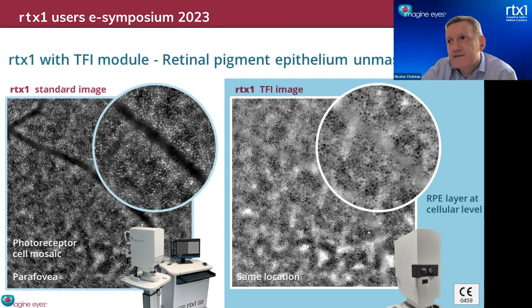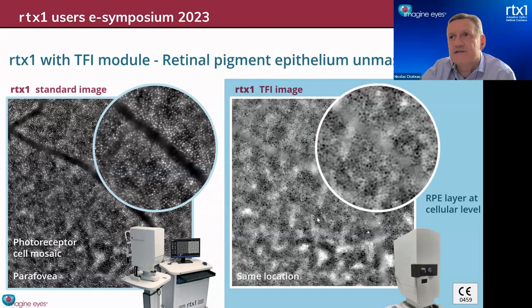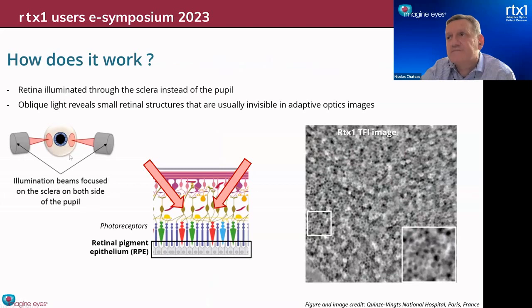So when we fit this module, the machine keeps the possibility to image in the standard way through the pupil, but it also adds the possibility of taking images with the transcleral illumination. This is how it works. We have two projectors on the side that illuminate the sclera through the pars plana, where it is the thinnest, so that the retina receives oblique light. And in this configuration, the photoreceptors, because of what is known as the Stiles-Crawford effect, do not reflect the light, and we can obtain this kind of images.